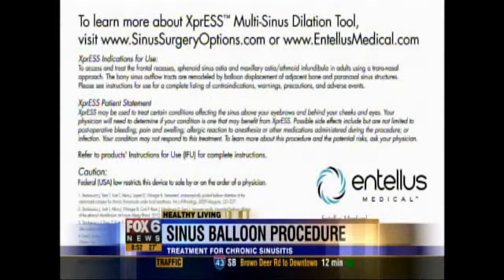Right. Now, do all doctors have this technology, or where can people go for this? No, there are some folks who do have it. I guess the biggest change that's happened over the last couple of years is you can do this in the office, kind of like going to the dentist's office, getting a filling done. We get things numbed up, we can get it done. You go home the same day, you're back to work the next day. Pretty slick in the grand scheme of things, and effective.